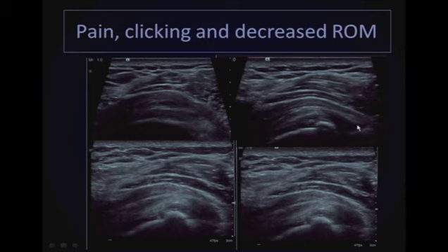We have the supraspinatus tendon, part of the rotator cuff. And then we have the underlying humeral head and greater tuberosity. So we have all 4 layers. We do not have a cuff tear or a defect in the layers.